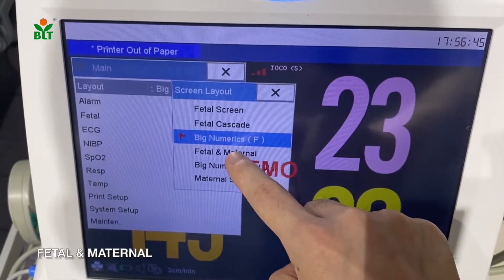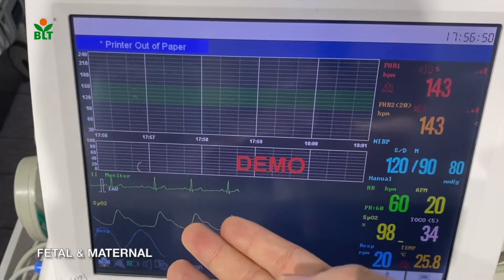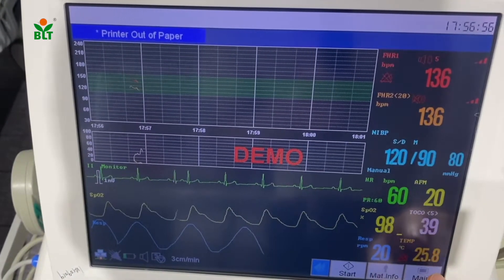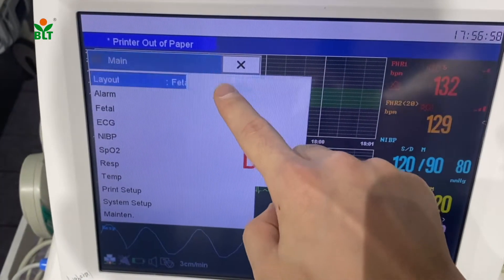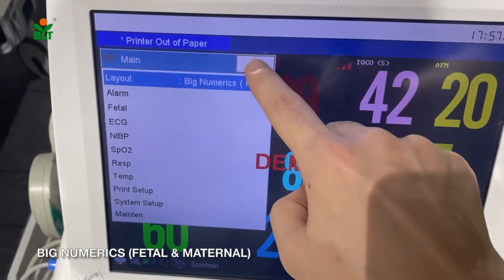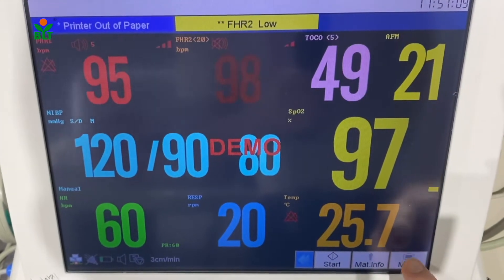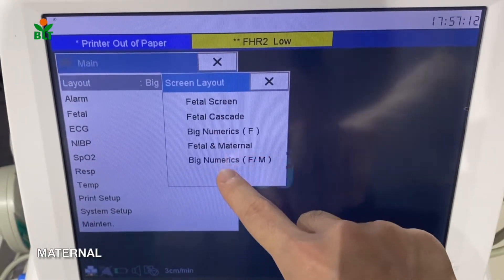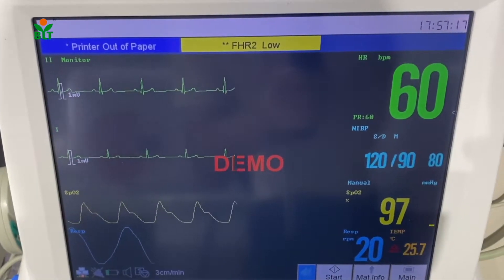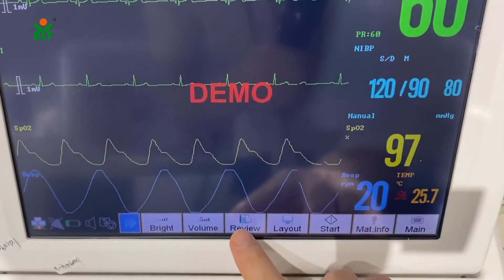Next will be the fetal and maternal screen. We can also see ECG waveforms, SPO2, and respiration waveforms. We can choose big numeric display for fetal and maternal parameters.